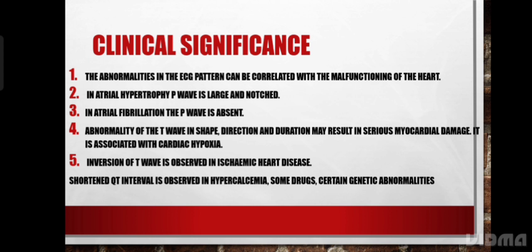Clinical significance. First, abnormality in ECG pattern can be correlated with the malfunctioning of the heart. Second, in atrial hypertrophy, P wave is large and notched. Third, in atrial fibrillation, the P wave is absent.